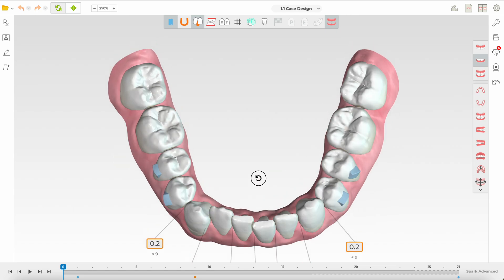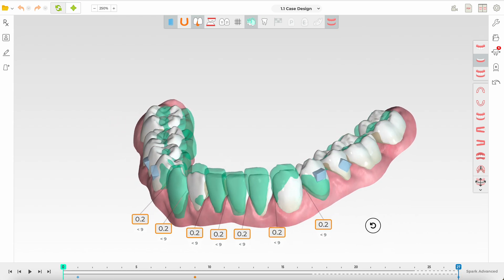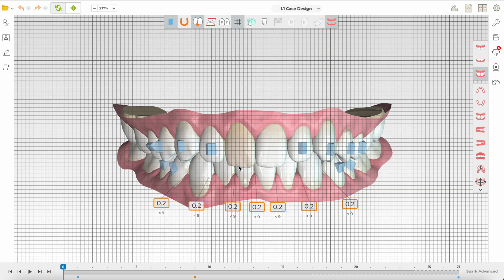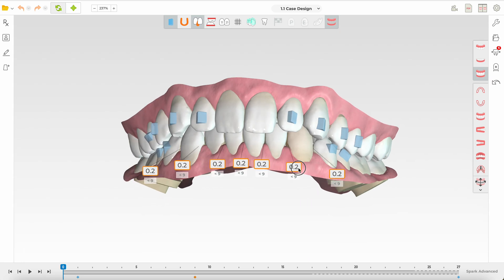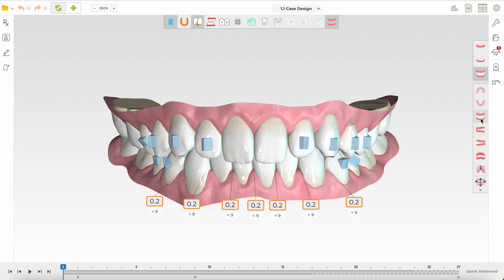Looking at the lower arch, based on the instructions given, the dentist probably thought this was a deep bite case. Again, it is erroneous to believe this is a deep bite case because there are unusually long central incisors. We know the normal length of a central incisor, and these do look longish — which could give the impression of a deep overbite. However, the overbite is only very mildly increased, something that doesn't even need treatment.